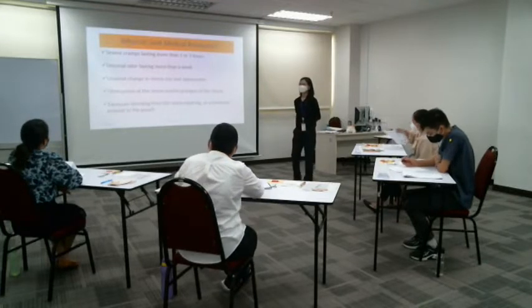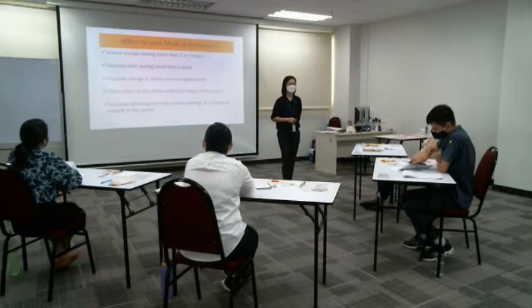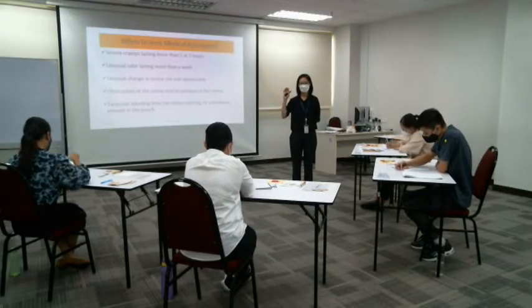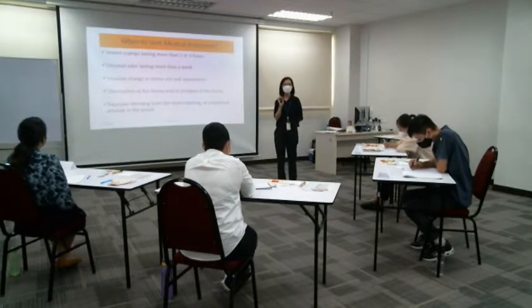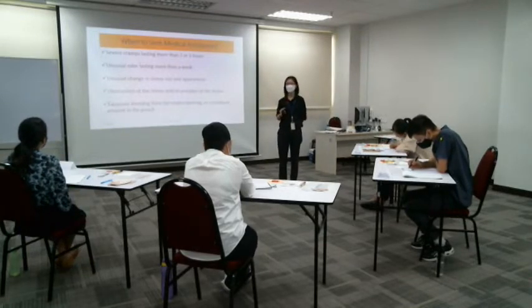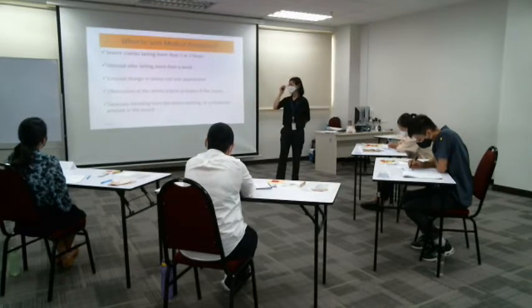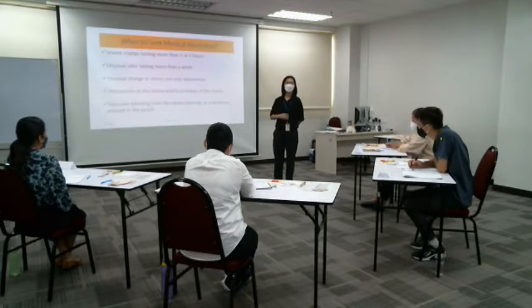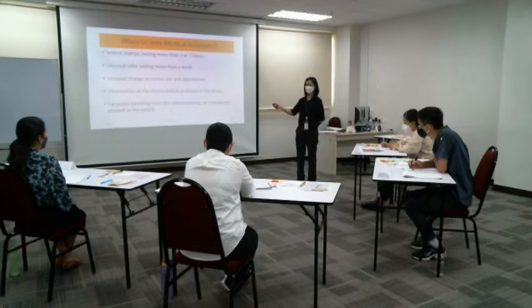Next is when to seek medical assistance. You go through the complications of stoma care, identify them, and know how to treat some common minor complications. Now, you need to tell the patient when to seek medical assistance. Severe cramps lasting more than 2 to 3 hours means something is not right. In this case, they must go see the doctor.